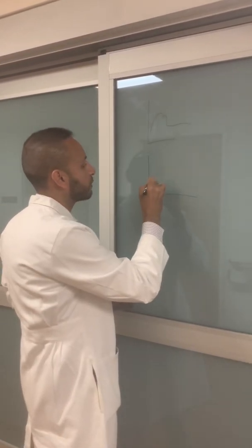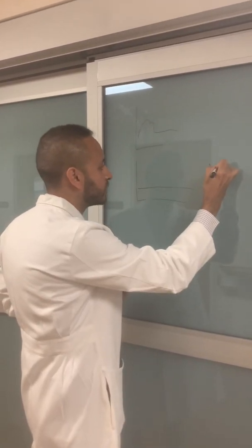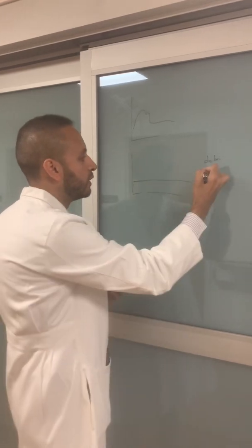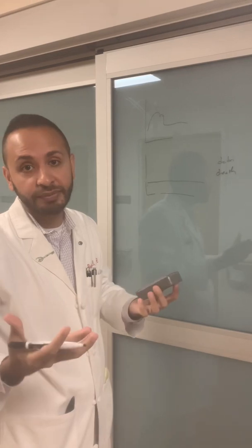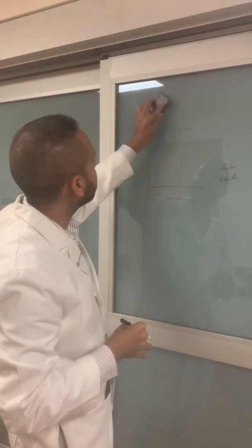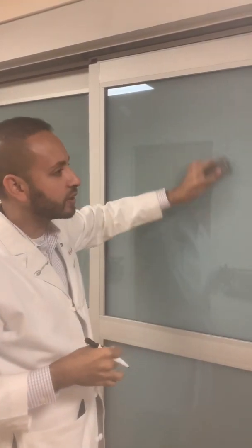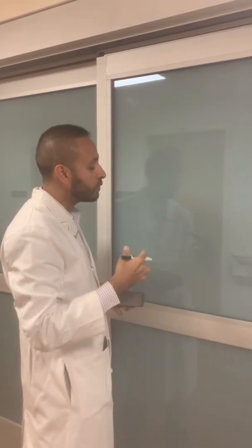Now, if your patient's waveform is like this, there's really two reasons. Again, it's debris, something's wrong, some sort of obstruction, whatever, or hopefully not, but death, right? So you should not have a waveform when you're brain dead, okay? So when you're doing a brain death exam and you have an ICP waveform and there's an actual waveform on there, the patient's not really passed away, right? Because you cannot have a waveform without brain function or brain flow.